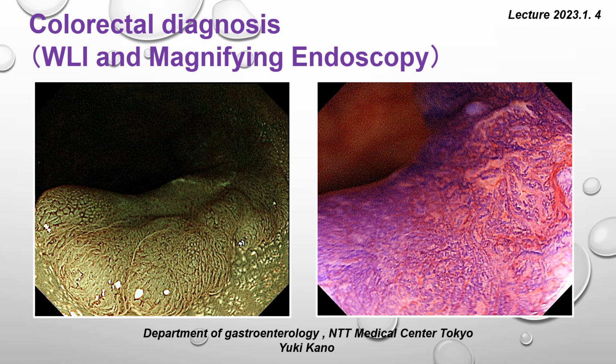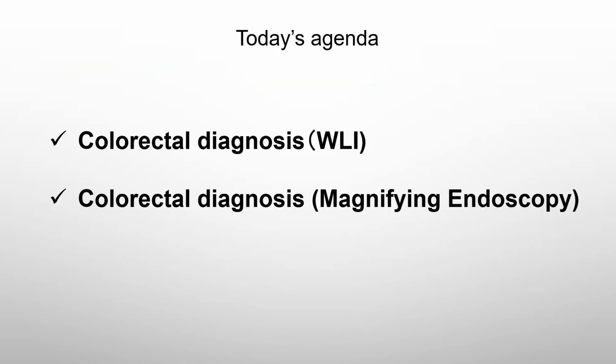We will give a presentation about colorectal diagnosis. Today's agenda is as follows. First, let's talk about colorectal diagnosis by white light imaging.